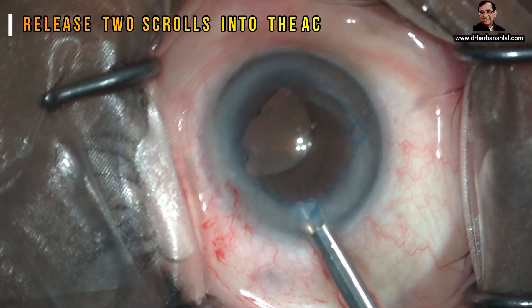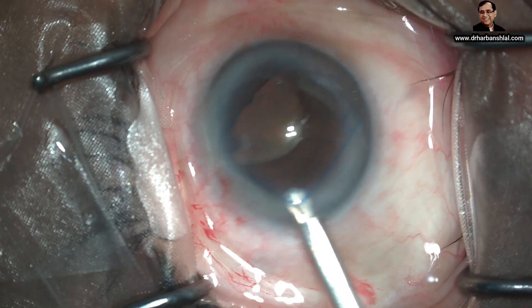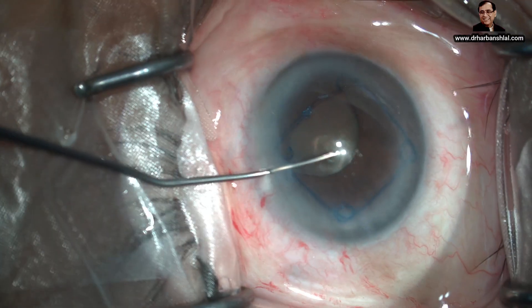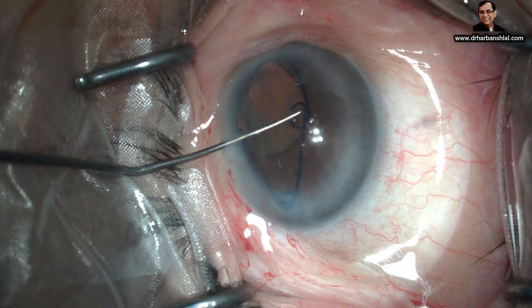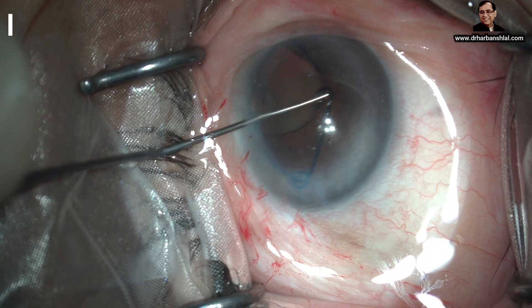We engage the left side because my side port incision is on the left hand side, and I can easily use that side port incision for engaging the right scroll. So the right scroll is pulled, engages the iris border, and we push it.